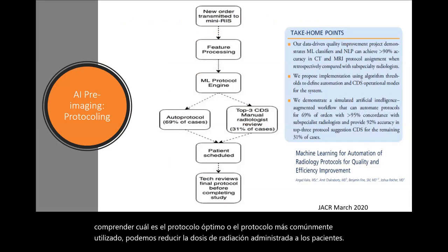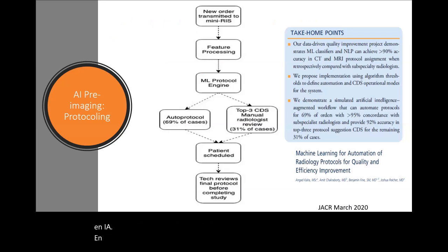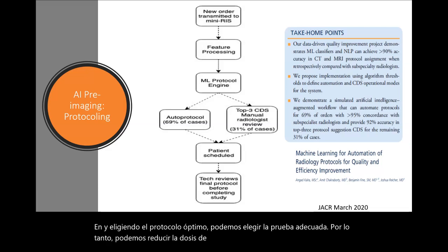The take-home point is by using AI-based tools and choosing the optimal protocol, we can choose the appropriate test. Therefore, we can reduce the radiation dose, and also there is a benefit for potential cost savings in these patients.